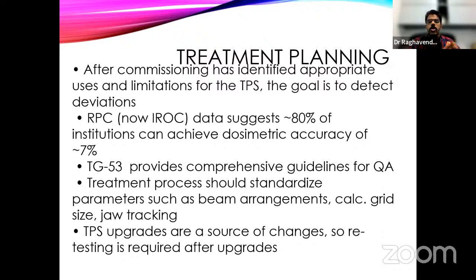So this is more precise. Now coming to the small field dosimetry problem. In model based systems or database systems, as I said, if the data is wrong, your output is also wrong. But in case of a Monte Carlo algorithm, if your data is wrong, your output is not influenced so much. That means the Monte Carlo dose system is not taking the measured values. It only uses them for the final dose normalization. It doesn't use anything else for dose calculation. That should be very clear.